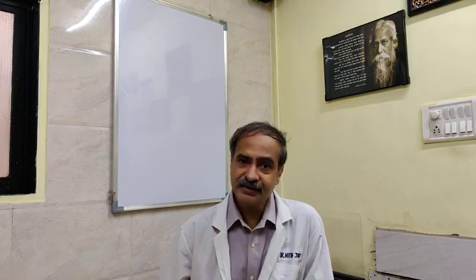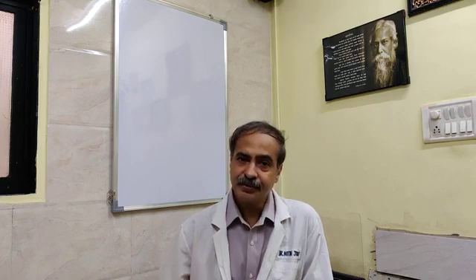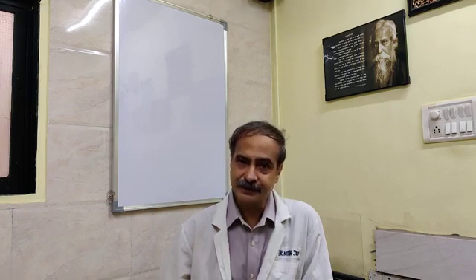Also, if there is deep resection in the lateral part of the internal sphincter, then there can be a free perforation at the vesico-prostatic junction. So it is important to define properly the internal sphincter and spare its fibers.